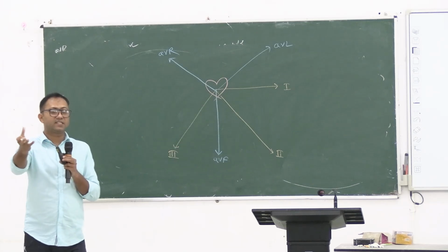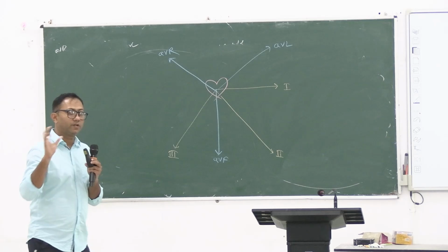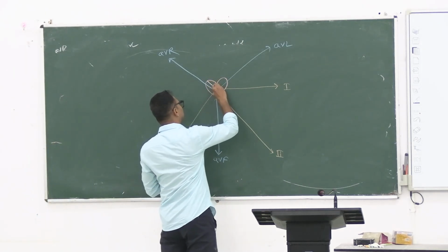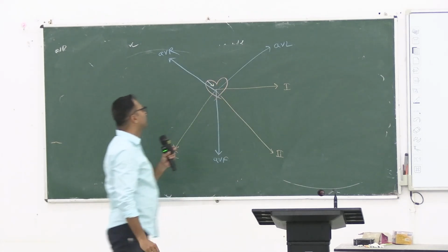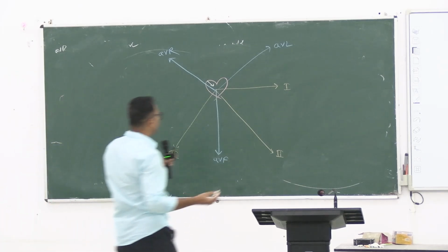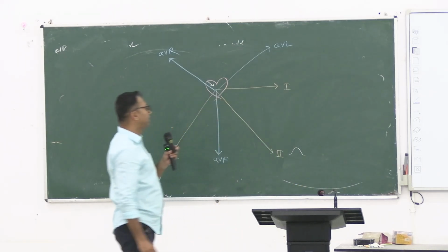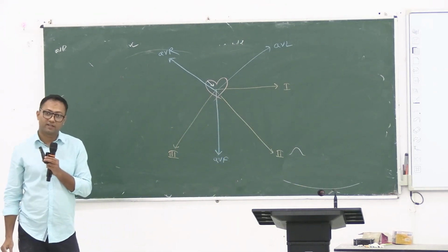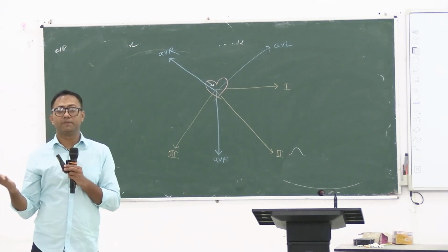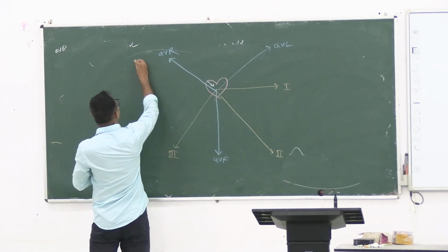Now, simply again take the example of the atrial depolarization vector. Direction is this. It is moving towards which lead? Lead 2. So the maximum amplitude of this P wave will be in lead 2. Now tell me, looking at the picture, in which lead will the P wave be negative? Yes, in AVR the P wave will be negative.